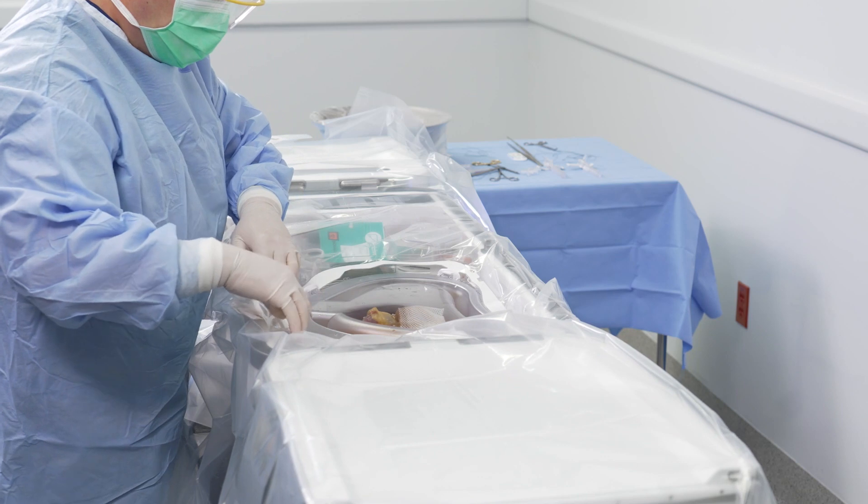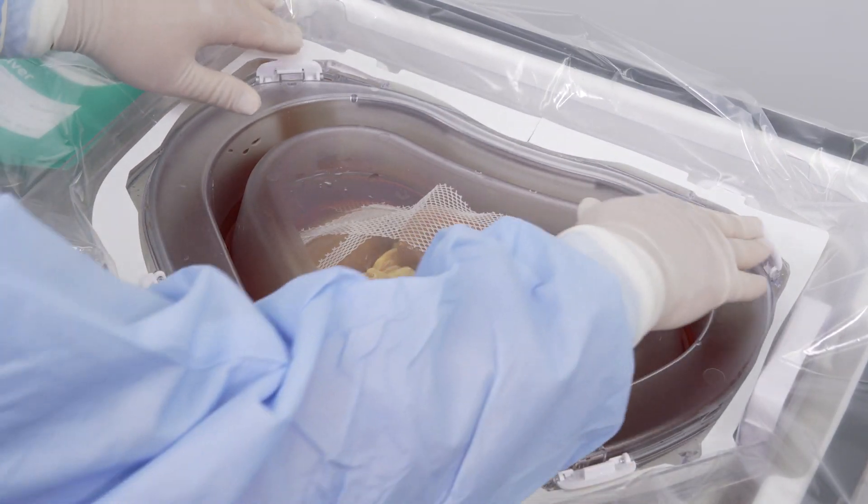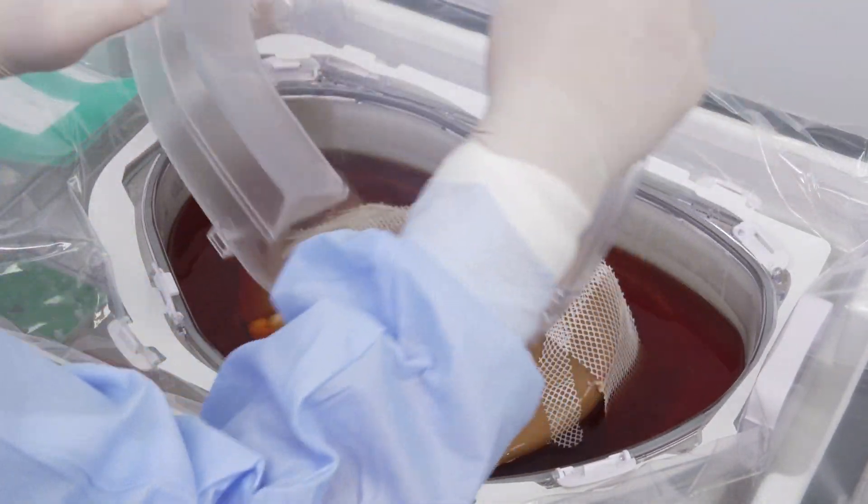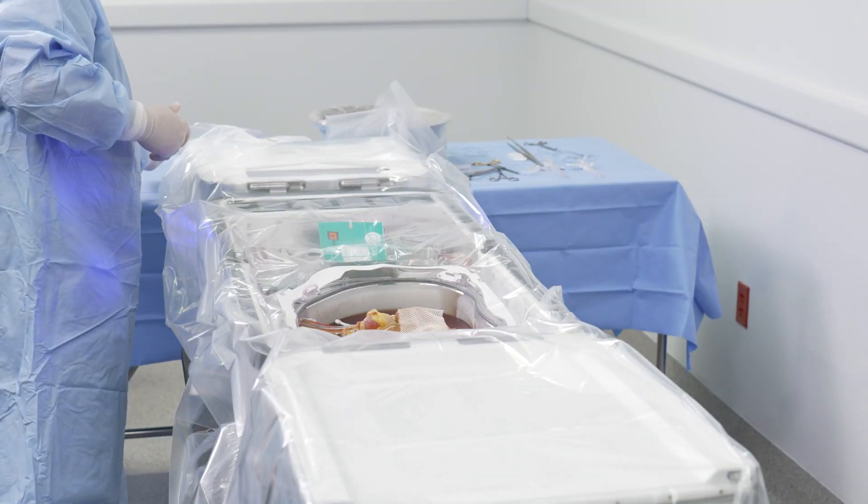After successfully placing and securing the drape, unlatch and remove the inner perfusion circuit lid. Place the lid face down onto the sterile field.